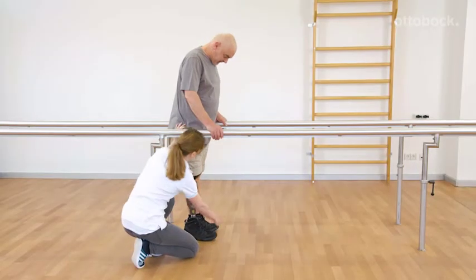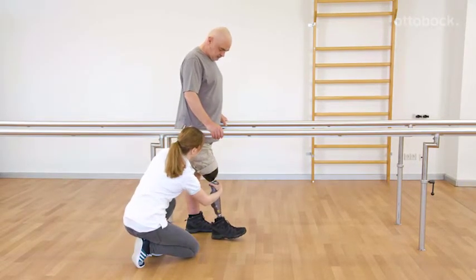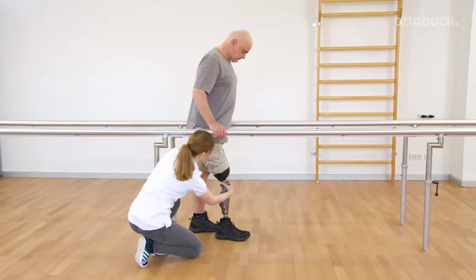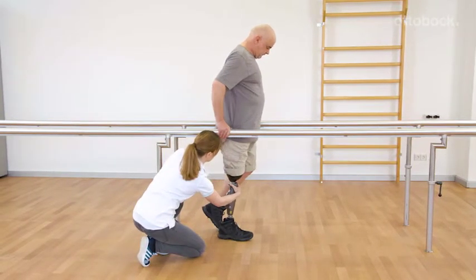The knee joint bends slightly during initial contact and loading response when observing physiological gait. This movement serves as a shock absorber, relieves the musculoskeletal system, and provides safety through a faster foot flat position.